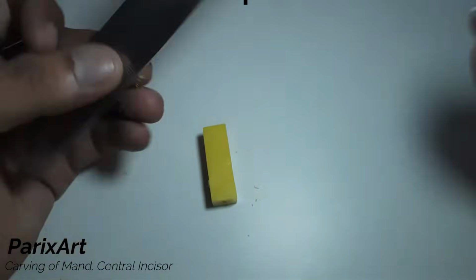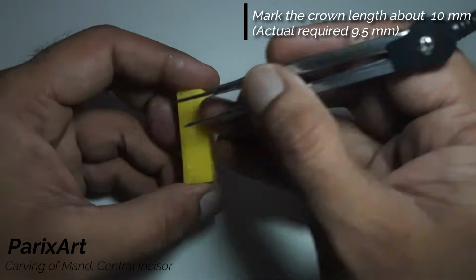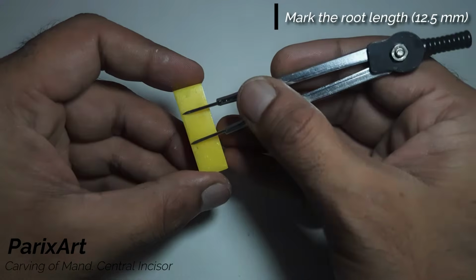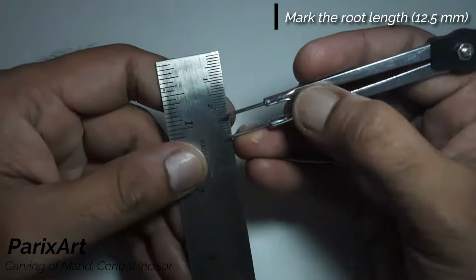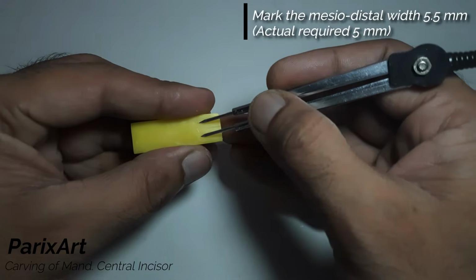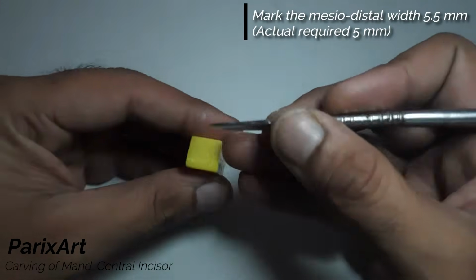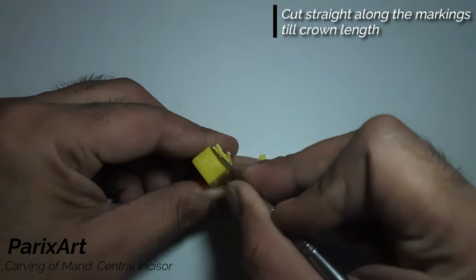Next we'll be marking the dimensions of the tooth. Our crown portion measures 9.5 mm. And now the root length, which is 12.5 mm. Now mark the mesio-distal width of the crown, that is 5 mm, but we'll take 0.5 mm extra. Mark it on the top of the block and also on the opposite. Now we'll cut straight along these markings to the crown length.